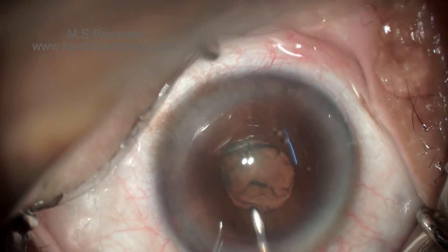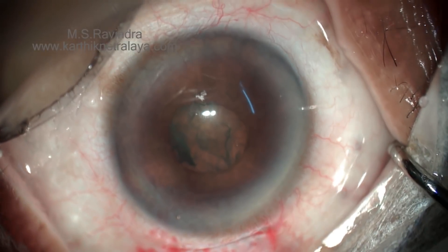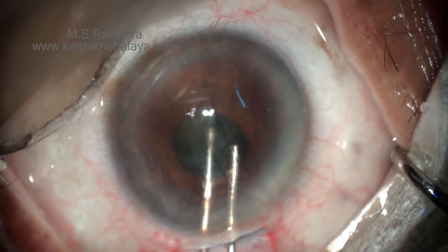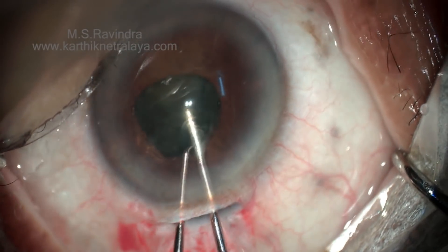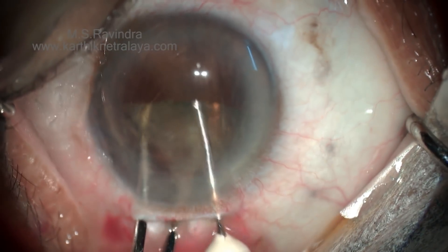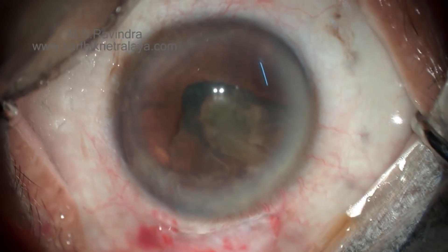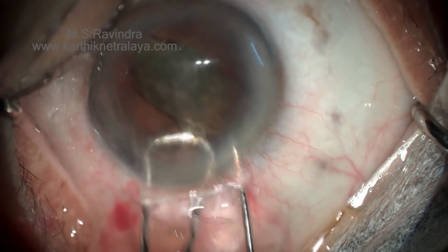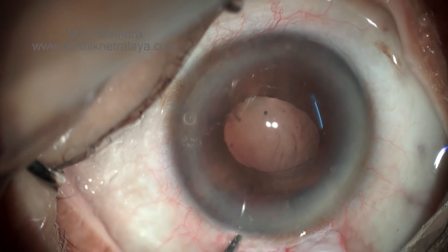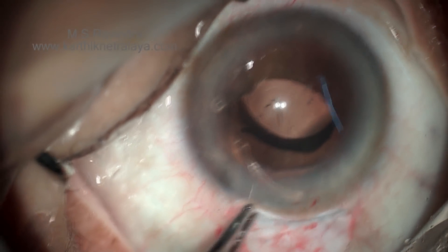This is a small-pupil case. You can do a capsulotomy larger than the visible capsule by going underneath it. The capsulotomy is performed under viscoelastic with a deep chamber. Rotate the nucleus and cartwheel it to the anterior chamber by lifting one edge. In this case, because of severe IFIS, the iris itself is moving. I normally avoid bisecting the nucleus when half of it is still in the posterior chamber, as I have had a few posterior capsular tears in such situations. Here it was unavoidable, so I carefully performed the bisection with the nucleus still in the posterior chamber and then placed the lens in the capsular bag.